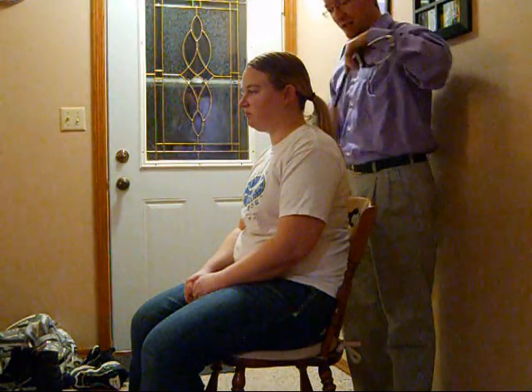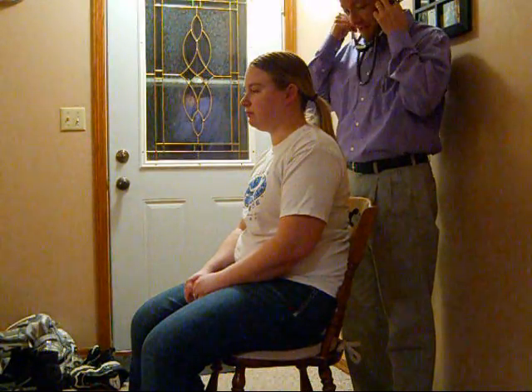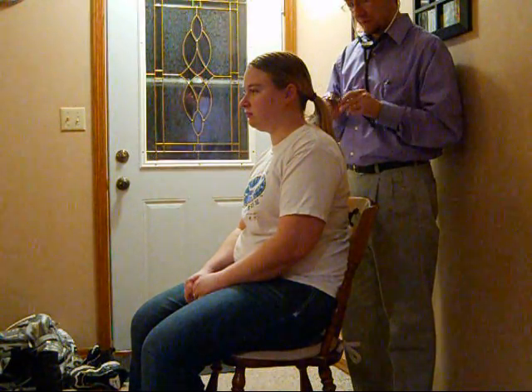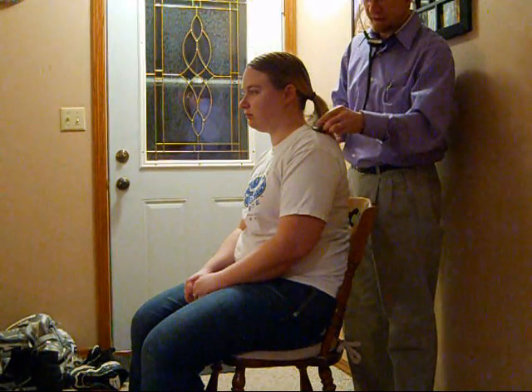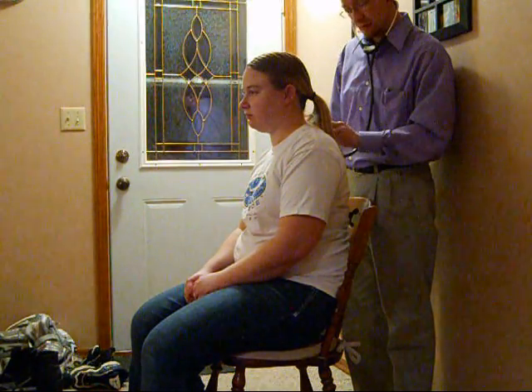I'm going to move on to auscultation now, using the diaphragm of my stethoscope. Starting at the top, I'm going to hear bronco-vesicular sounds. Again, comparing side to side. Making sure to stay between the shoulder blades. Hearing vesicular sounds now.